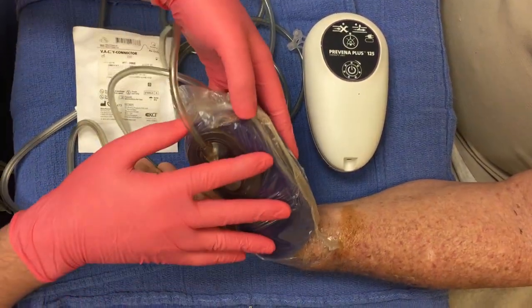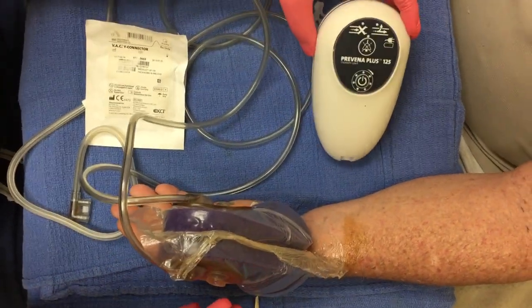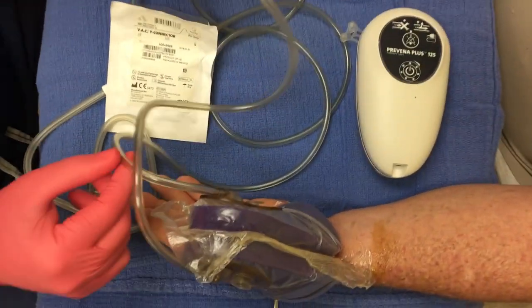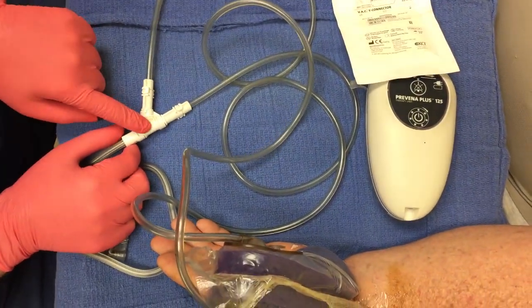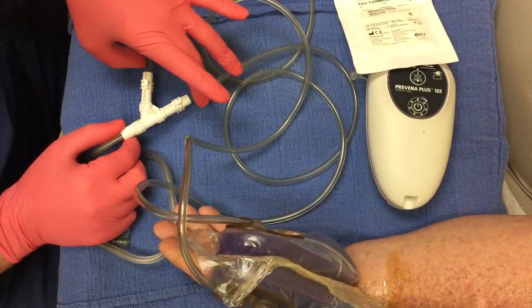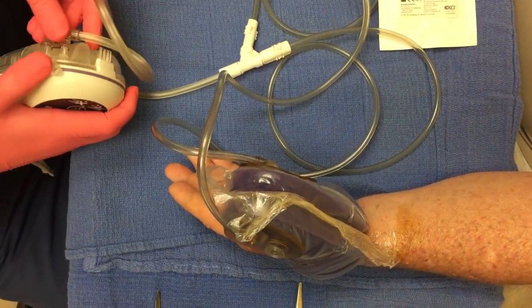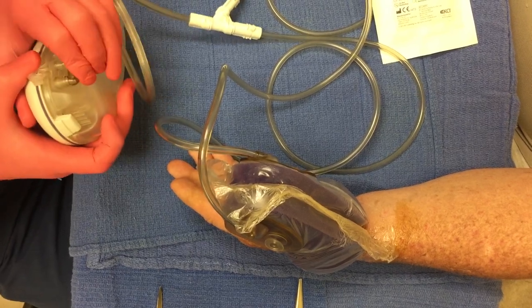Once we've gotten our two Prevena sponges on — you can see one and two, we've done the sandwich. Here's the Prevena pump; we put the backing on here. This is the canister on the back of the pump. You can see the two cords come down to a Y connector. Each of the Prevena adapters goes on to the end of the cord, and then these feed into the Y connector. We connect this to the Prevena canister in the back like this. Make sure it's nice and snug.